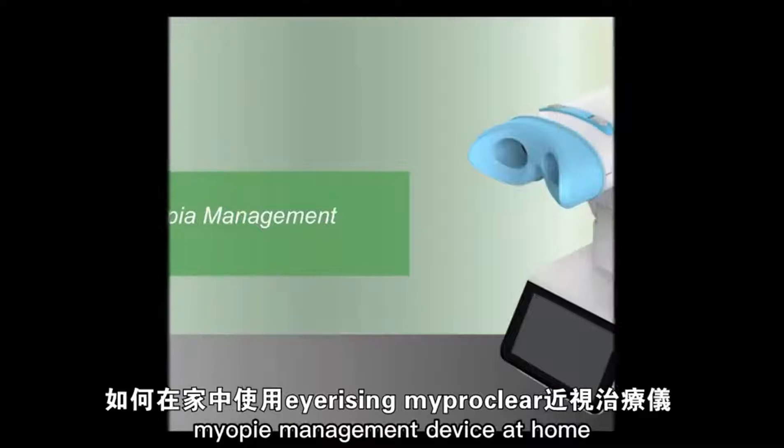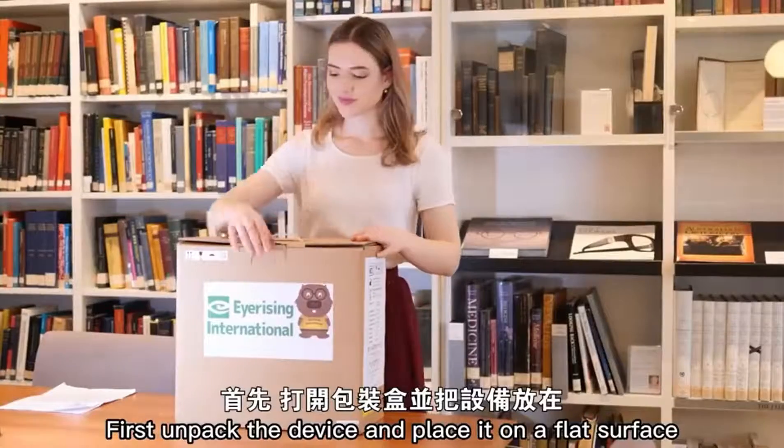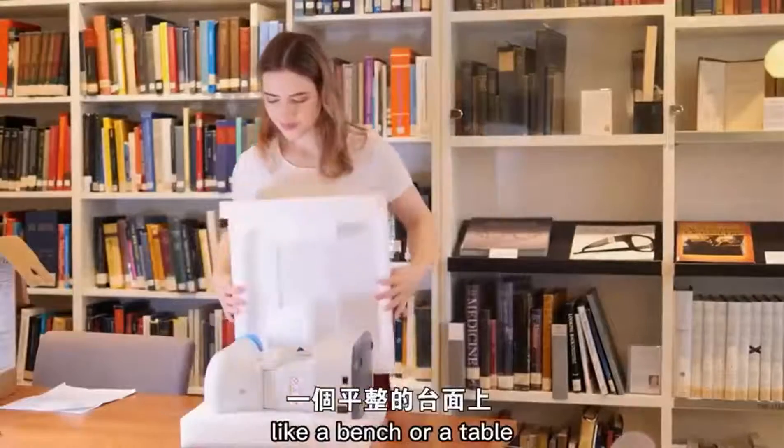This short video demonstrates how to use the Eyerising myopia management device at home. First, unpack the device and place it on a flat surface like a bench or a table.